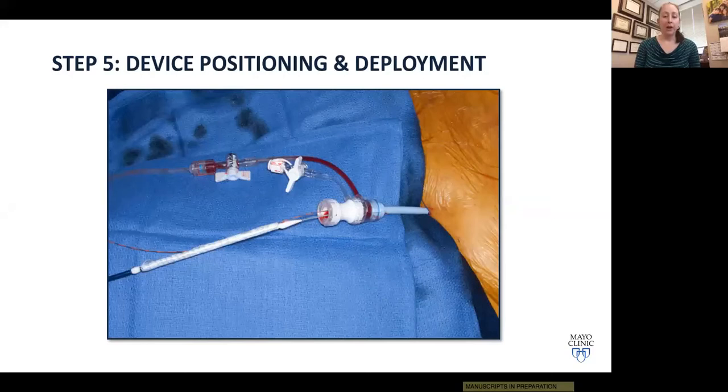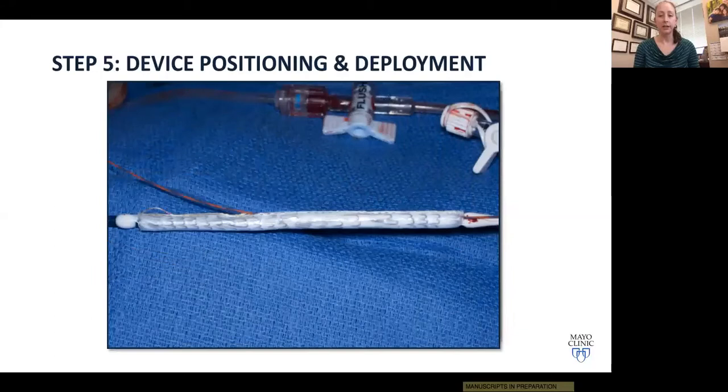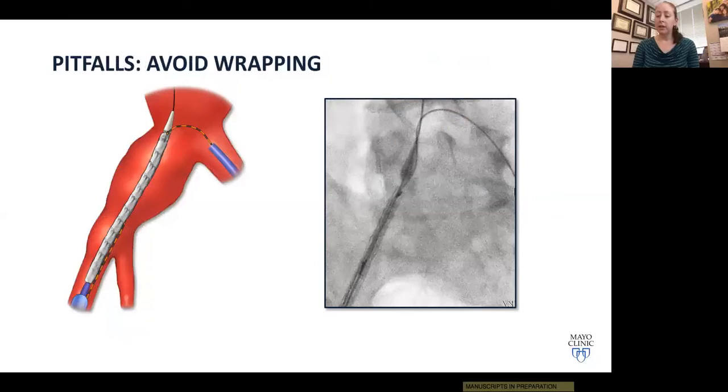We now advance the device into the Dry Seal sheath over both the through-and-through wire pre-cannulated through the internal iliac gate and over the stiff Lunderquist wire. Before advancing, make sure the sheath is positioned in the distal aorta to protect the device all the way up through the iliacs, then withdraw the sheath. One of the key steps is to make sure you haven't wrapped these two wires together — that will cause significant problems later. If you see wrapped wires on imaging, reorient your device until you achieve a parallel wire orientation.